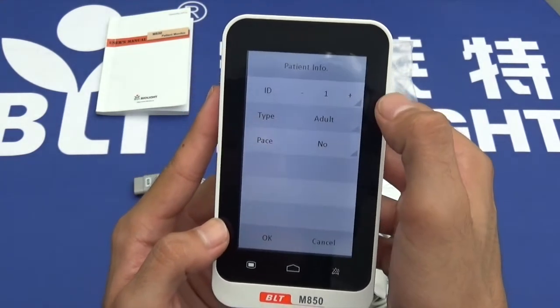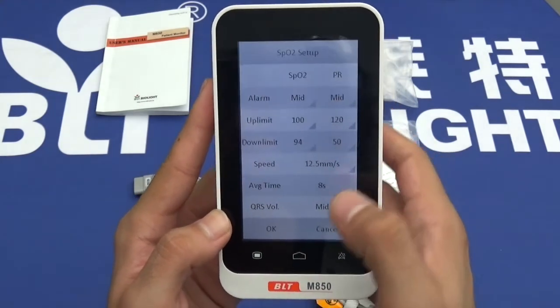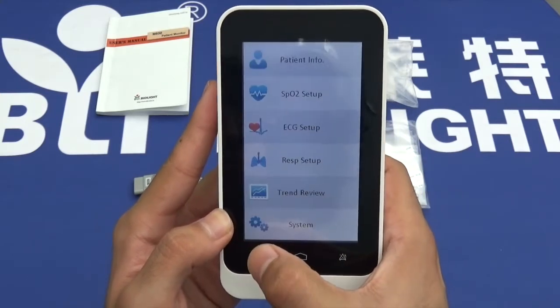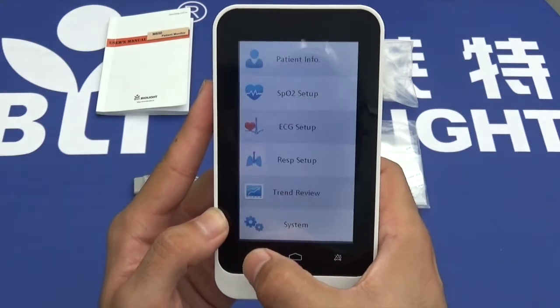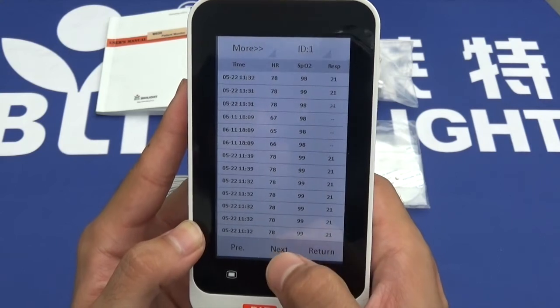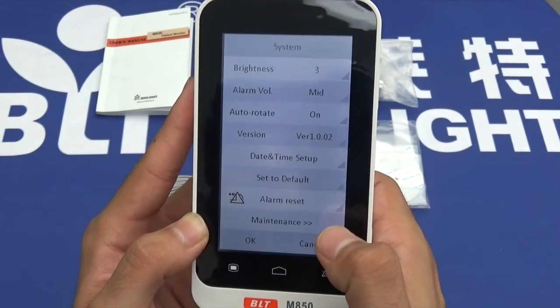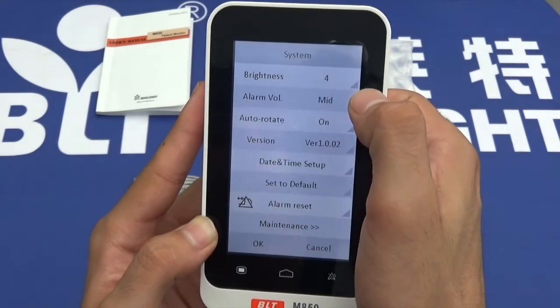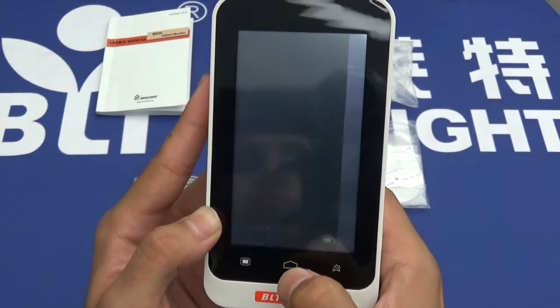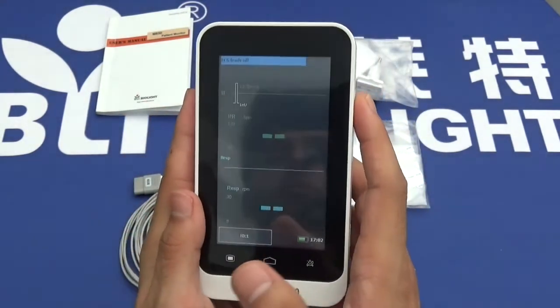From the menu you can select patient info, go back, SPO2 set up, ECG set up, respiration set up, trend review, go through the data, and system settings. To turn off, simply press and hold the same button used to turn it on.